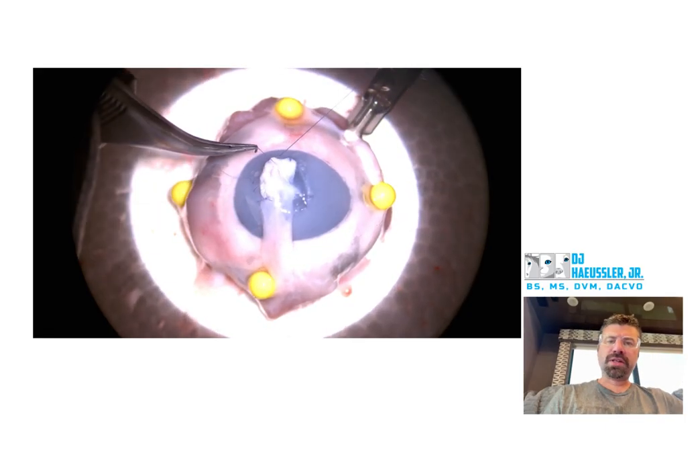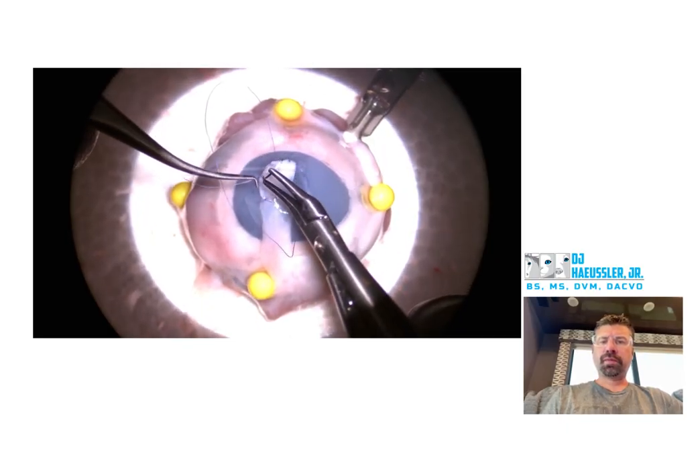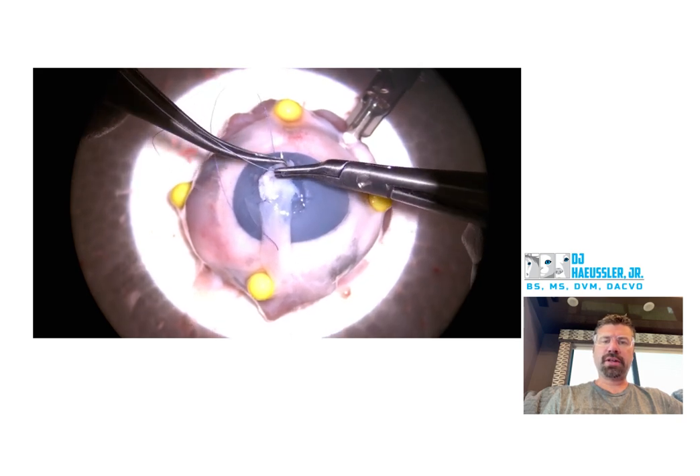Good job — that was a nice roll. The manipulation of your suture with your colibris is good.